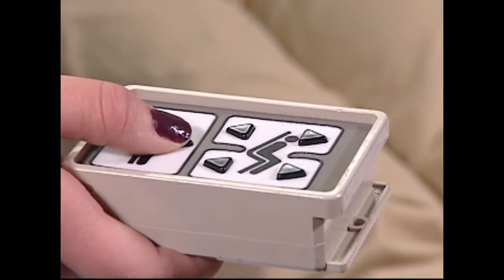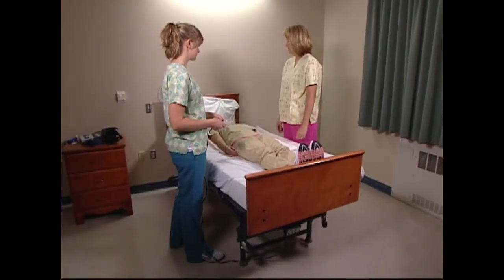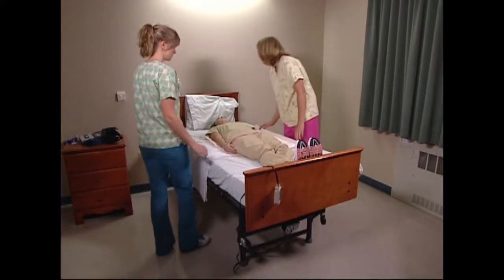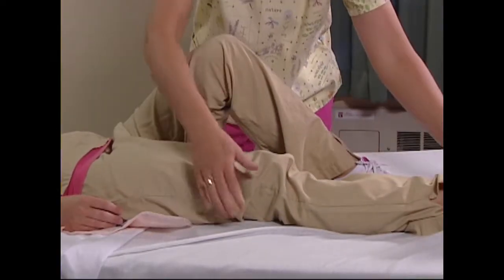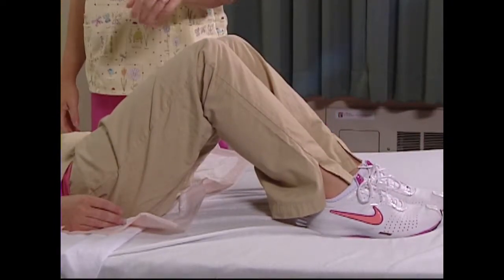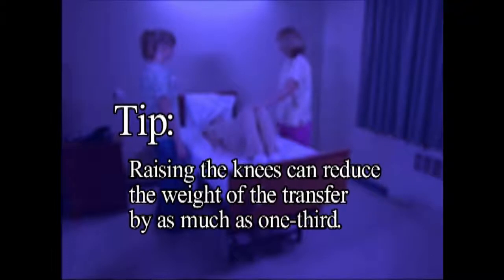Raise the bed to a safe working height. Use two people and a draw sheet; an incontinence pad or a combination of the two may be used. Ask the resident to assist if possible by bending their knees. If the resident has lower body strength, they may assist in the transfer by pressing down with their legs. By raising the knees alone, you can reduce the weight of the transfer by as much as one-third. Raising the knees reduces the body weight that is moved across the mattress.